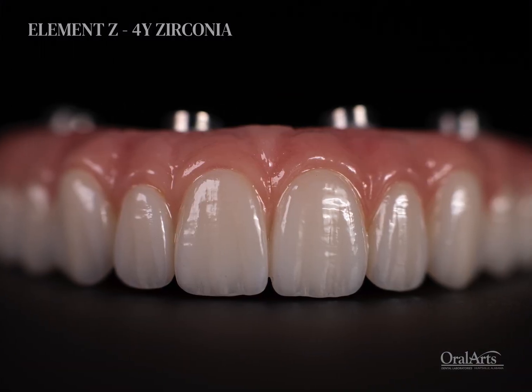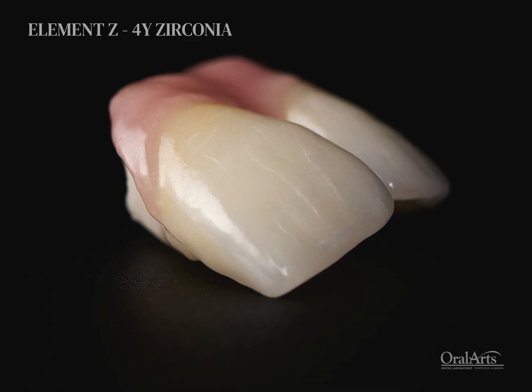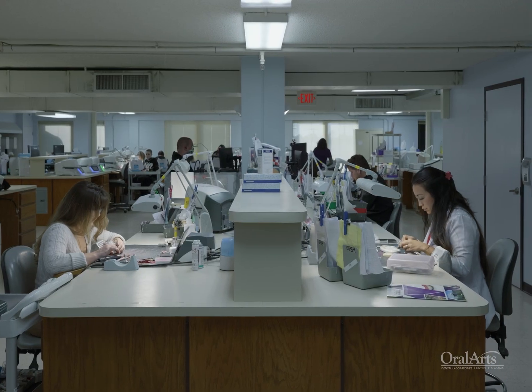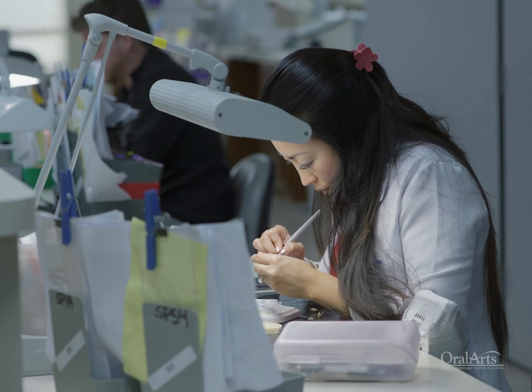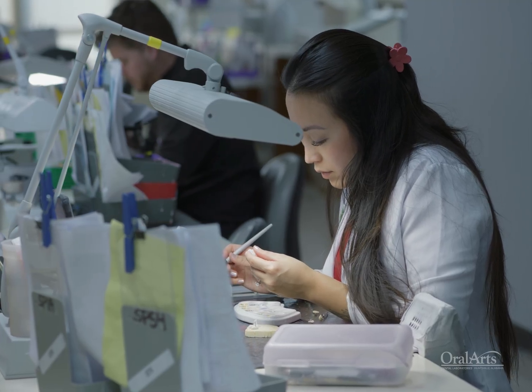You can either use it in a full monolithic state or you can layer a small amount of porcelain on top of it to make it look even more lifelike. The most important resource is the experience of the technicians and customer service here at the lab.